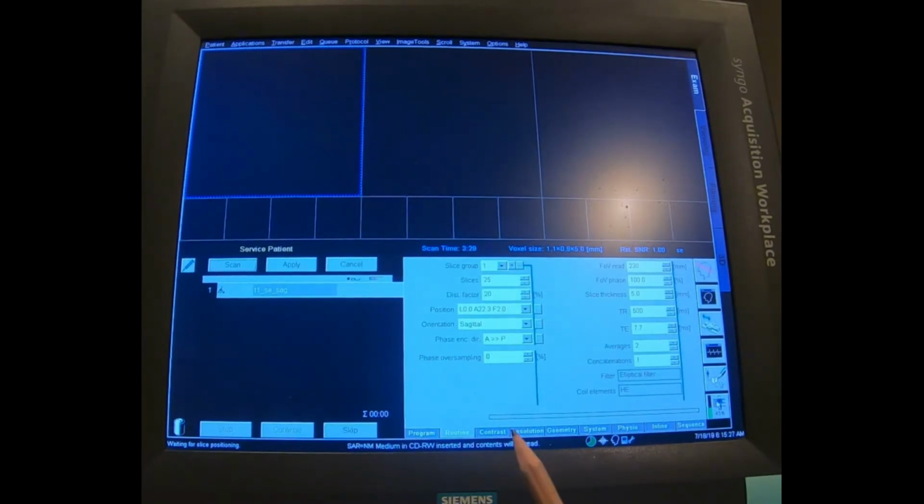Each patient has a specific absorption rate. Well, in MR, there's no ionizing radiation, but what does the RFPA do to flip the proton? It creates heat. What does heat do? Well, if you can't radiate heat fast enough, you'll start to overheat, you'll start to sweat, there could be problems. You know, if you're an older person, too much heat, you might get a stroke, things like that. So there are issues for safety for SAR.